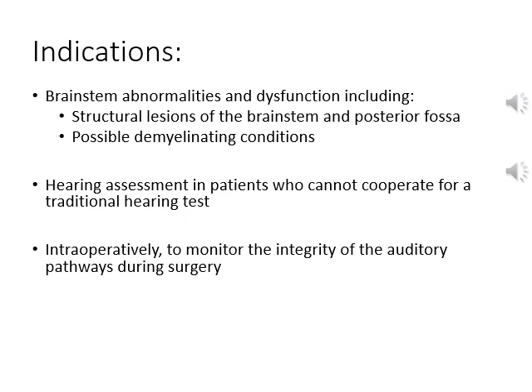Another indication for the BAEP is to assess hearing, especially in patients who cannot cooperate for a traditional hearing test. At Sick Kids, we do not do this very frequently, as most children with questions of hearing difficulty are sent to audiology where they will receive a more thorough assessment. The other population where we would be interested in hearing dysfunction is in newborns in the NICU.